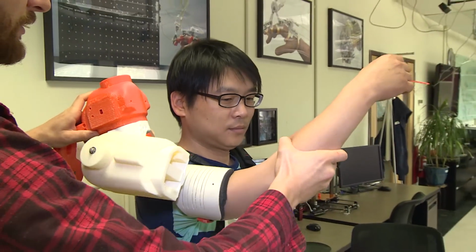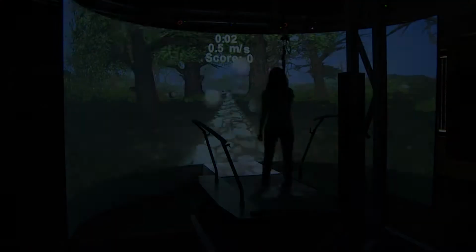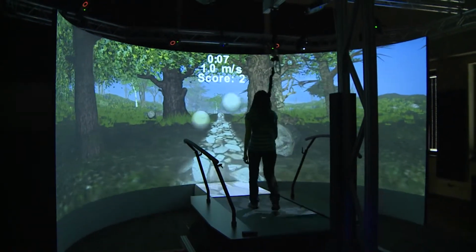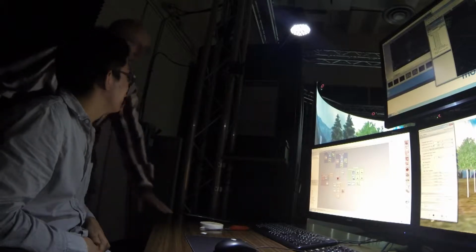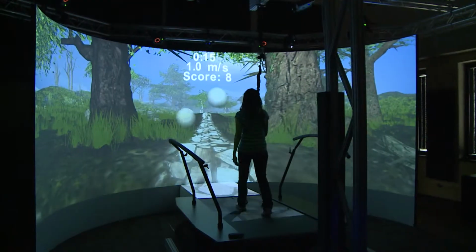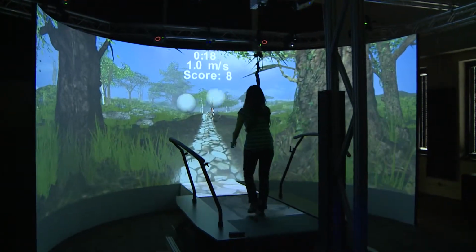In the future, I anticipate robots being fully integrated in the therapy setting, where they're taking some of the difficult load from the therapist and implementing therapy more precisely. So what we have here is a system where, with the treadmill, we can apply mechanical perturbations and essentially prod people mechanically while they're walking. We can change the speeds of the treadmill belt, and we can prod their somatosensory information, the sensory information they get from their feet and their legs while they're walking. We can perturb the visual information through the virtual reality and do visual perturbations.